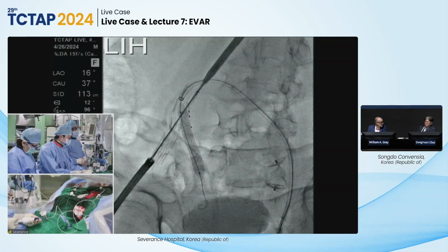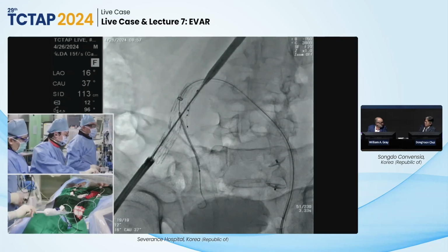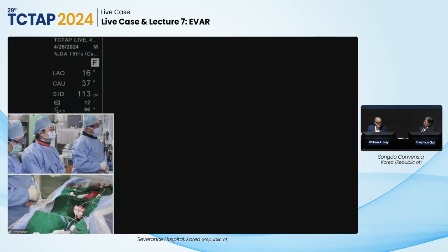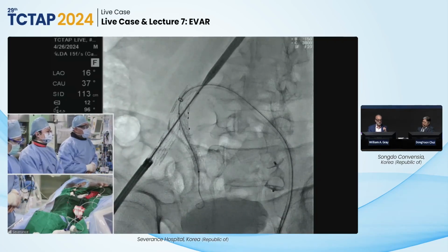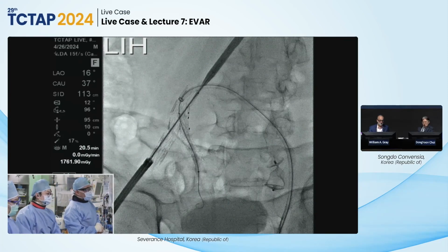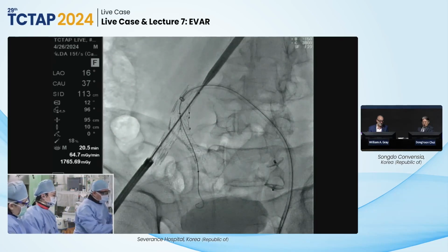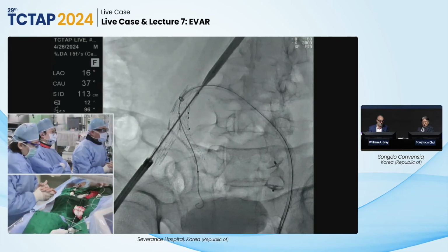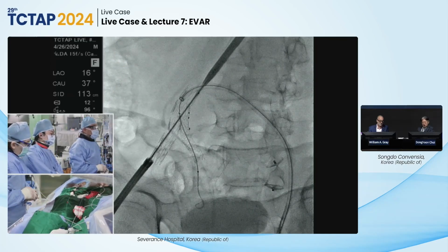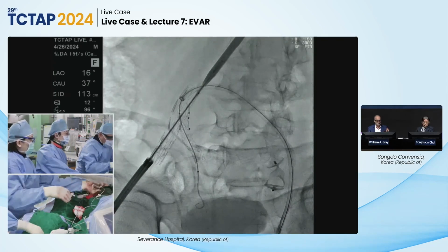We have not many options for only balloon expandable stent graft. In Korea we don't have the Viabahn, so Viabahn would be my first choice because it is very flexible, but here we don't have it. We have 2 balloon expandable covered stents and 1 self-expandable stent graft, but the profile is bigger with the self-expanding stent graft.